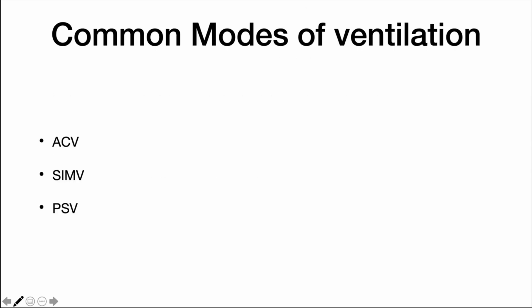The three most commonly used modes of mechanical ventilation are assist control ventilation, SIMV, and pressure support ventilation. Each mode describes whether a breath is volume constant or pressure constant, which breaths are mandatory or spontaneous, or both, and which variables determine a change in function. All three modes have uses throughout the spectrum of stabilisation of ventilation, maintenance of ventilation, and weaning from mechanical support.